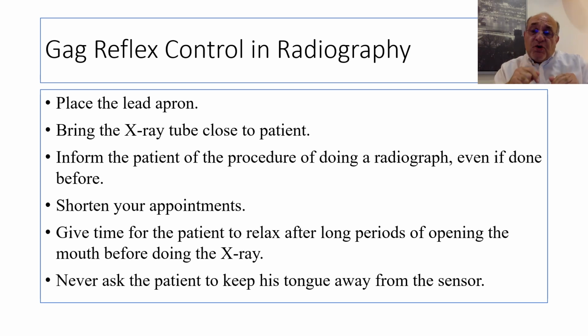So when you are going to take a radiograph after a long time of the mouth being open, please give the patient time to relax the muscles. Because if you directly open the mouth after a long procedure and then put the sensor, you would expect that the cooperation of the patient will be less, and he will be more prone to the gagging reflex.